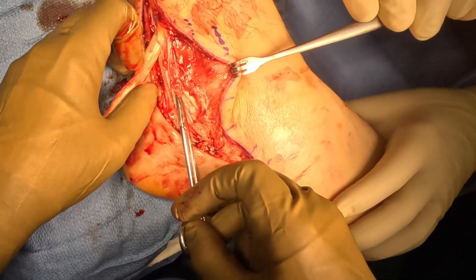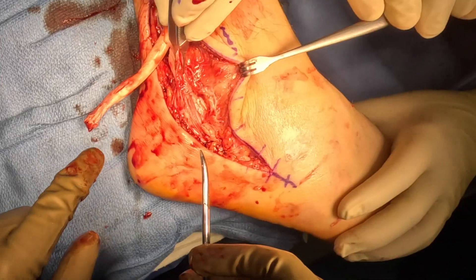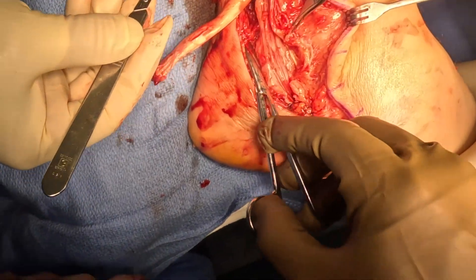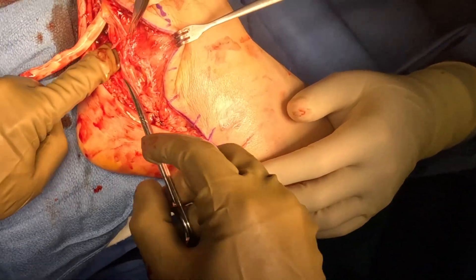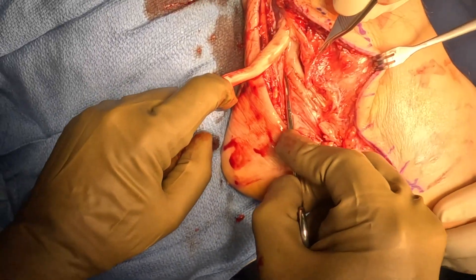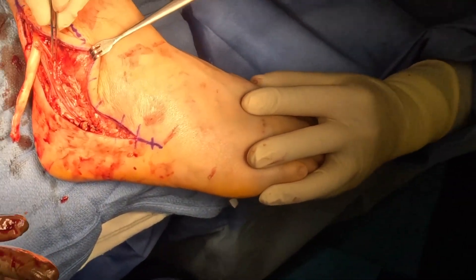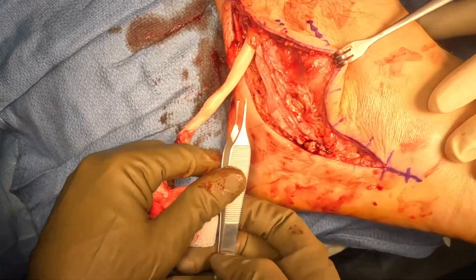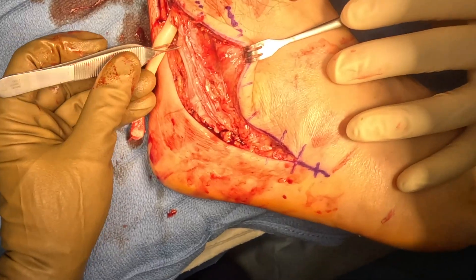Now you can see we're dissecting that longus tendon, pulling it backwards, and we're going to dissect down to find the brevis tendon. If you look closely here, it is almost completely ruptured as well. As we dissect in and identify, you're going to see a portion of fibers connecting the more proximal end of the brevis tendon to the more distal end. And as you can see, once we expose it, it is almost completely ruptured — so it's a 90% rupture.